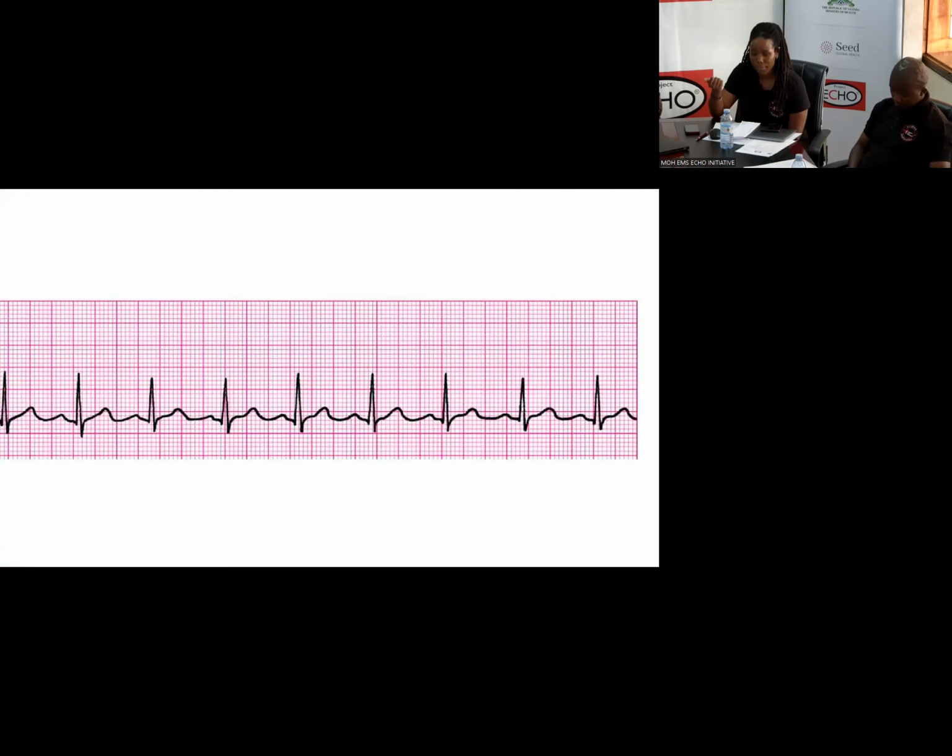We've done heart rate and we've done regularity. The next thing to look at is the P wave. As we were taught earlier, the P wave is a sign of atrial depolarization. So that's that wave right there. Typically, when we see it, we have a quick understanding that our sinoatrial node is functioning properly. At least we know that the signal coming through the conducting pathway is originating from the sinoatrial node. So when you see a P wave, you can assume that you're having a sinus rhythm.